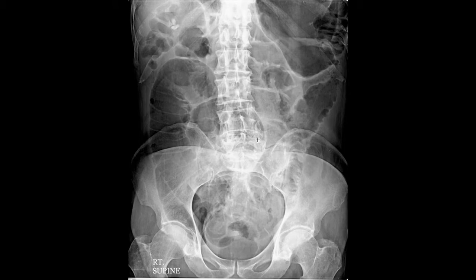So air will rather dissipate than actually rise or accumulate superiorly. You can see here distinctly in the evaluation criteria, the diaphragm is not included anymore. Why? Because air will not be found under the diaphragm due to the gravitational force and the movement of the air, as we said, in a supine position. But the pelvic region here is all included. Okay? So this is a successful technique to acquire abdomen images in the acute abdominal series.